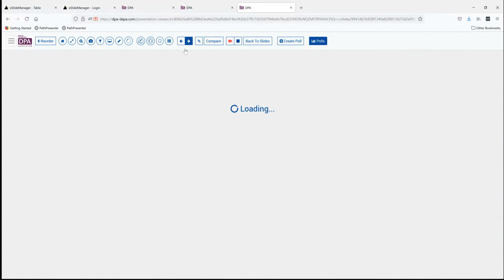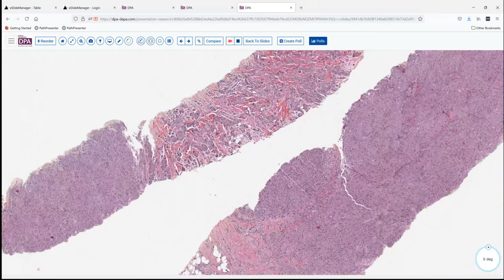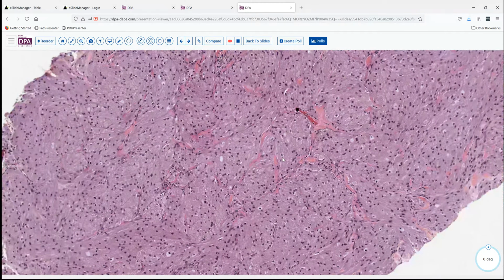Other locations you might encounter this is a breast biopsy. Here, I don't think you'd confuse this with infiltrating ductal carcinoma, but you might be concerned for a while if you looked at this and thought, gee, that looks like an infiltrative pattern. What's going on? What is this? You have to remember that's one of the skin adnexal structures where skin tumors can occur.